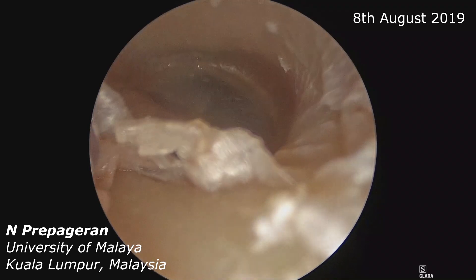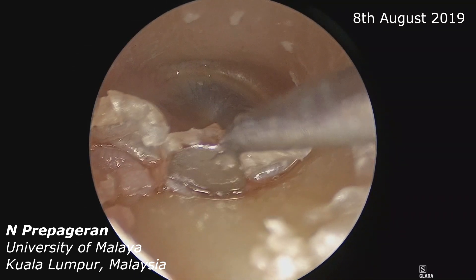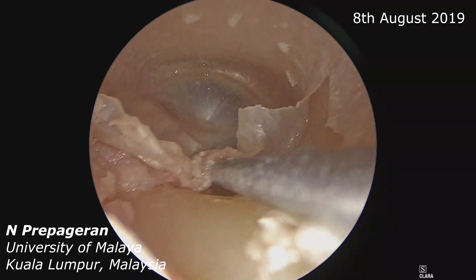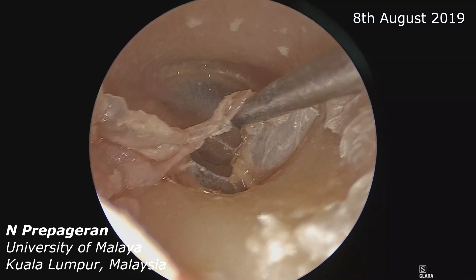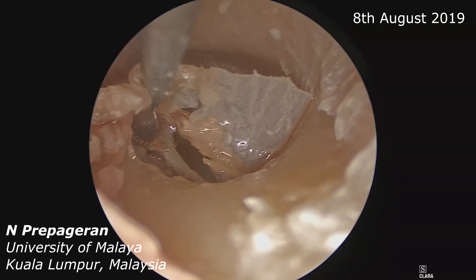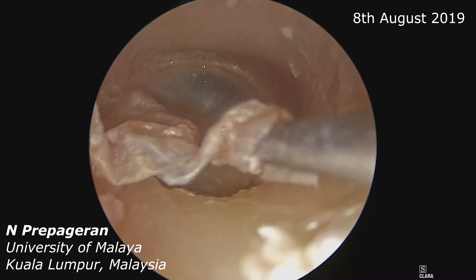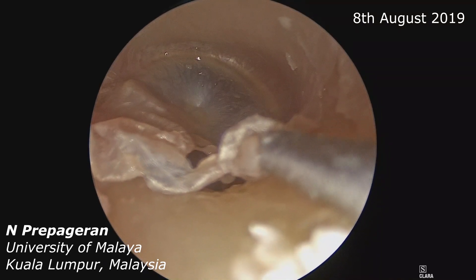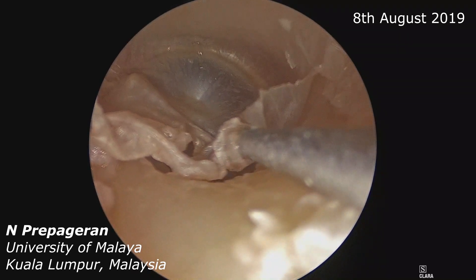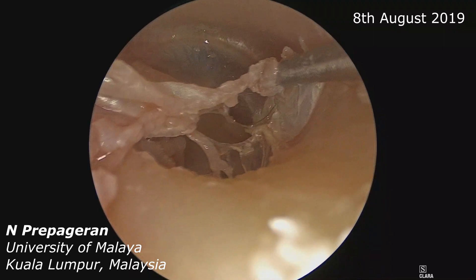Next, what we want to do is go all the way down to the annulus. Once we are at the annulus, we can lift it up — that's the annulus coming into view. Chorda tympani is coming into view as well. We dissect the annulus up, and now we are inside the middle ear space.